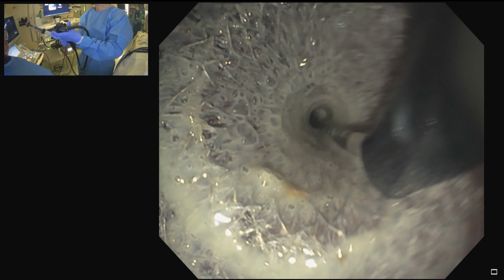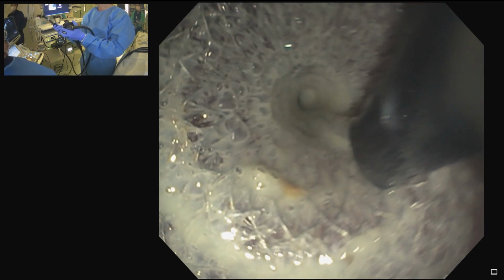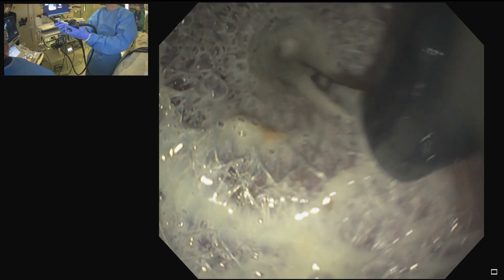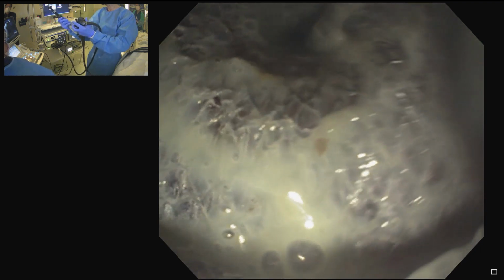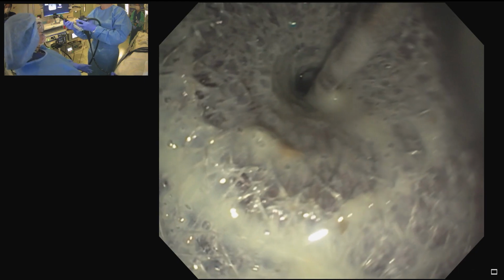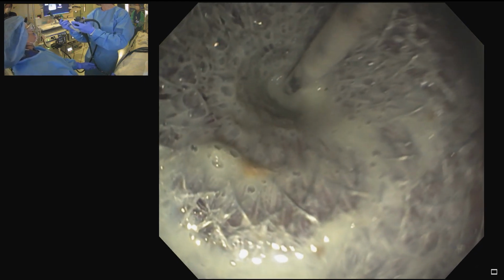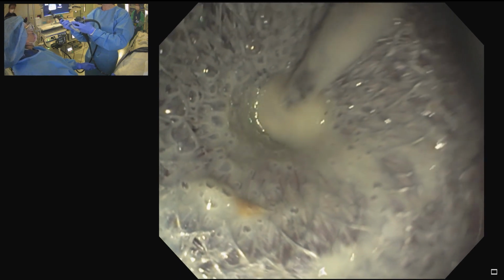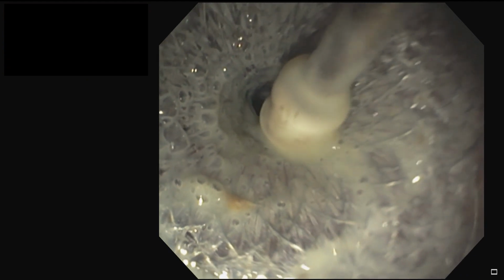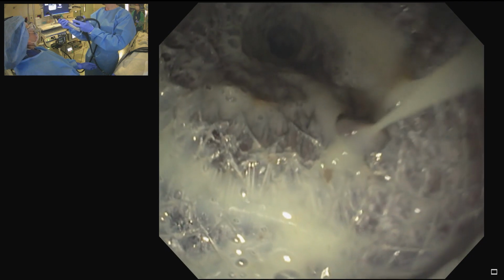So I'm going to very slowly try to pull back like this. See? I'm pulling back, watching, and I'm going to look for that ceramic tip here, and I want to keep it in view. I'm adjusting my position. This is maybe less critical for a fluid collection. This can easily happen when you're draining the gallbladder. All right, there's the ceramic bougie tip there, right? And we're going to just slide that right out.